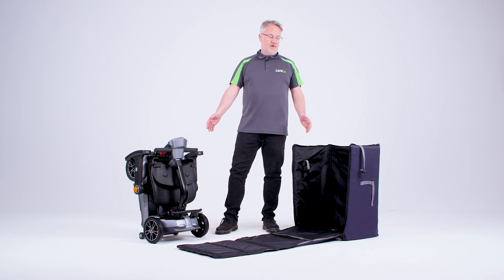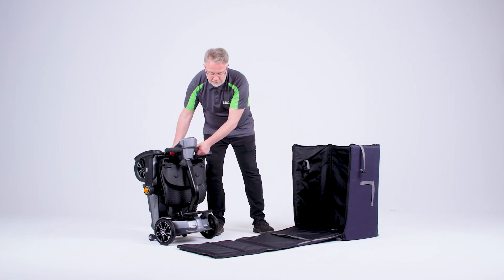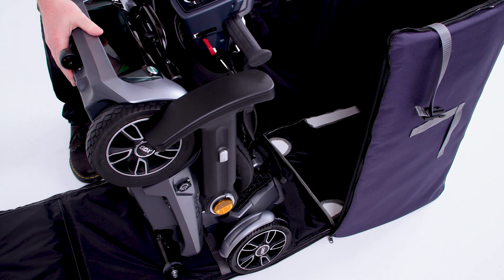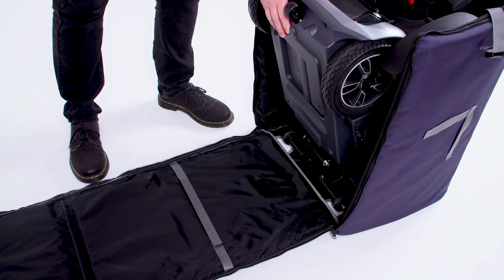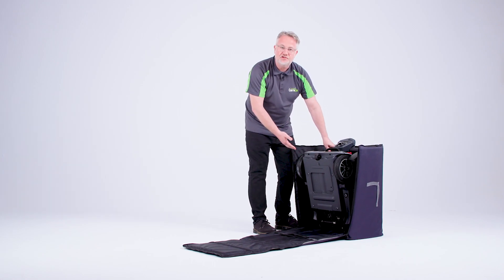To place the Nano into the bag, you can simply push it in. If needed you may lift it as well, but I find that it will fit in quite comfortably as so.